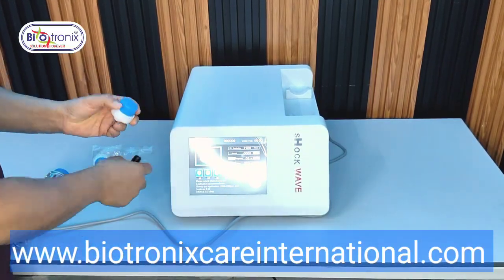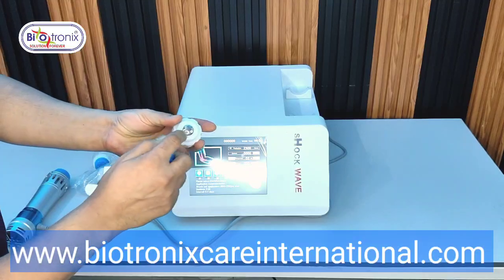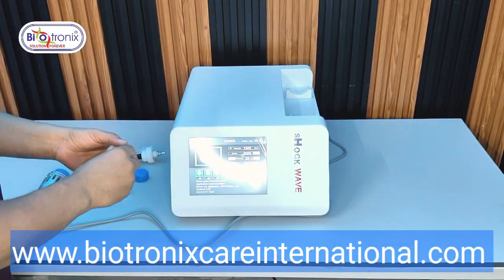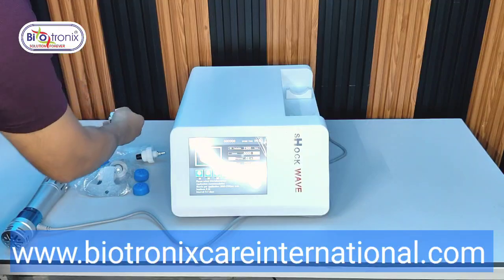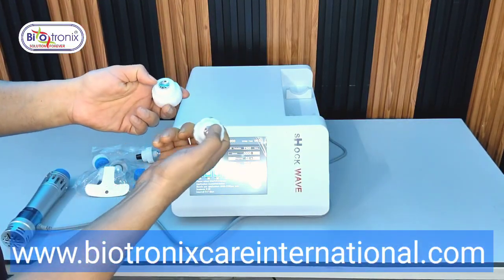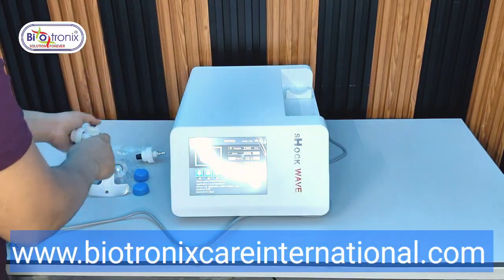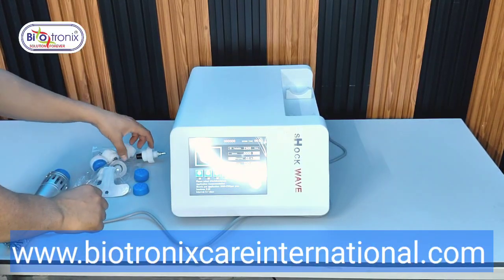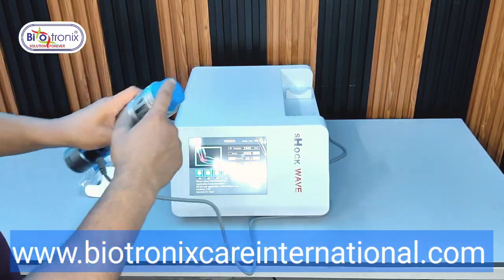You can see all are having covers, but they are having different metallic parts. You can see these are different. Like this is convex and this is concave. So there are 1, 2, 3, 4, 5, 6, 7. So there are 7 of them.